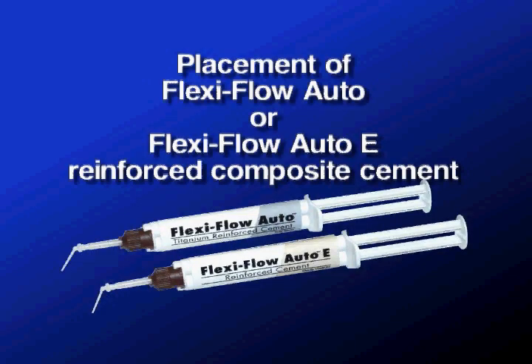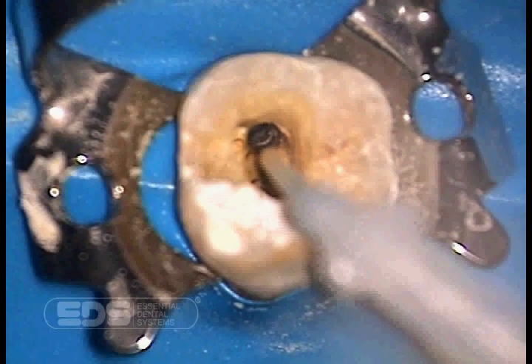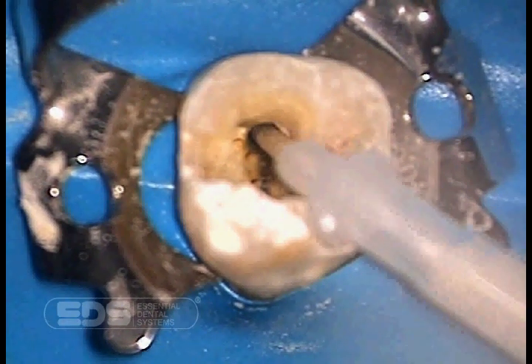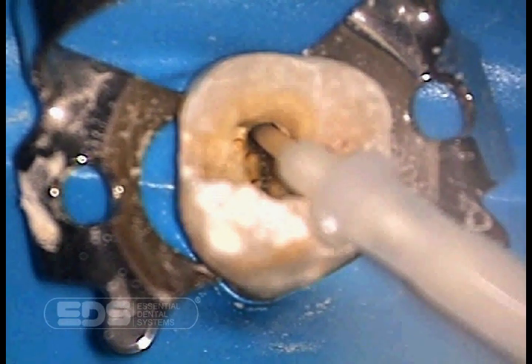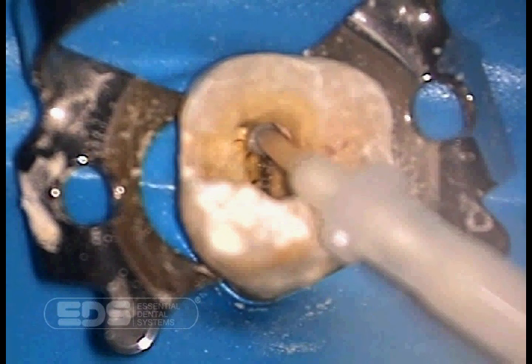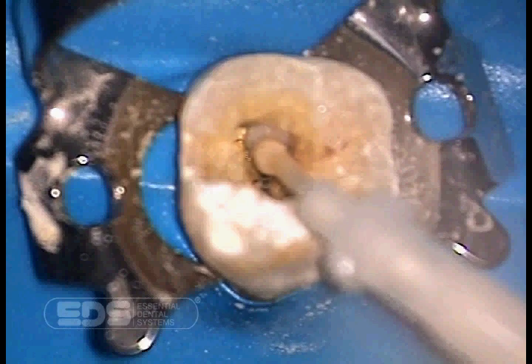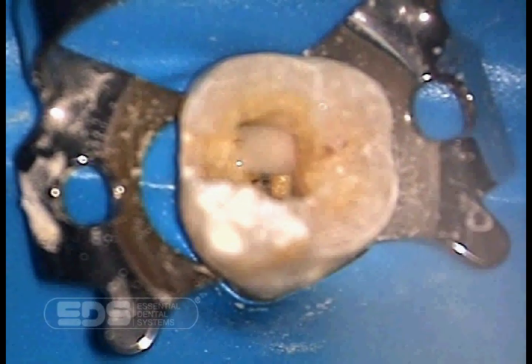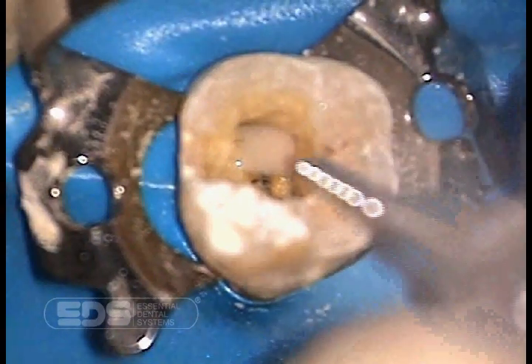We now use Flexi Auto-E reinforced composite cement to cement the post into the canal. It is expressed through the Auto-Mix syringe with a needle nose tip. This tip fits directly into the canal, allowing direct and very easy placement of the post cement. The canal is filled entirely with cement and the post is threaded into the cement and into the post hole.